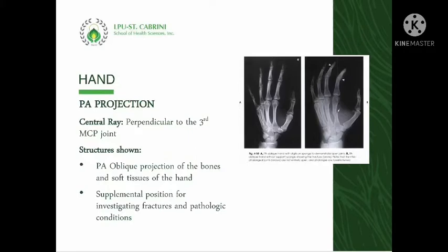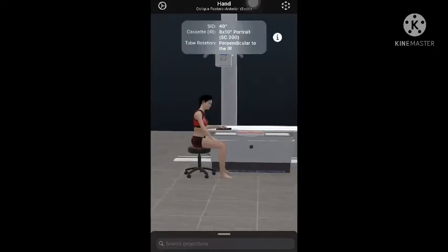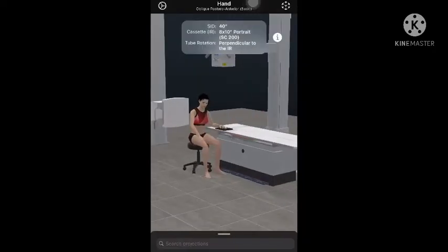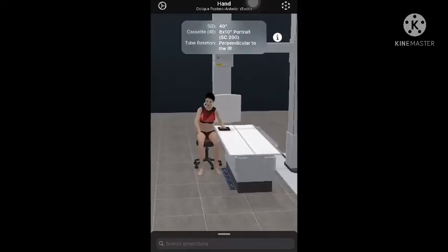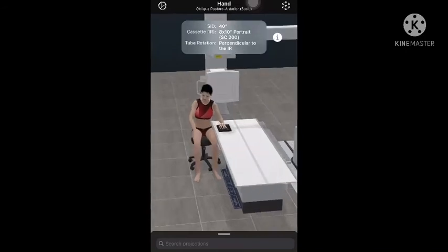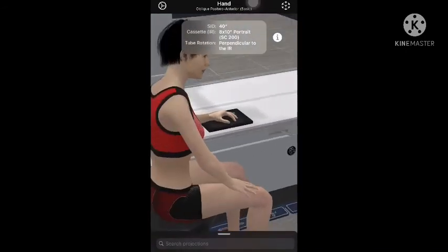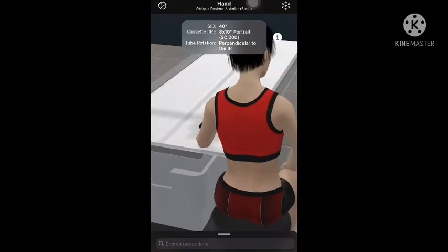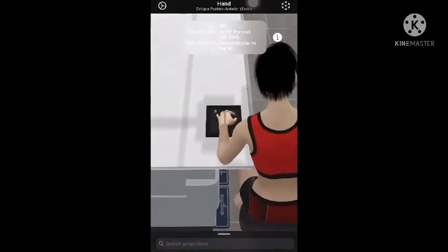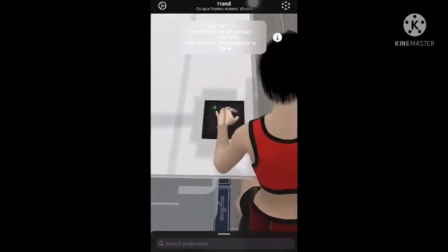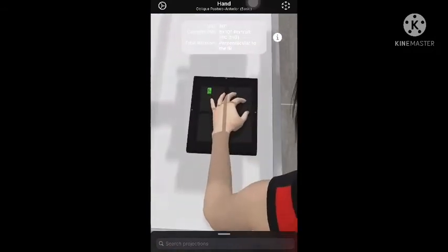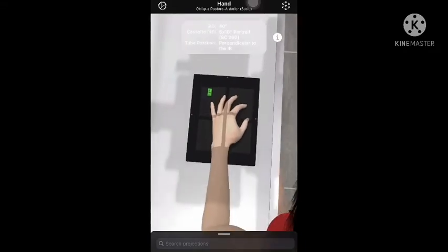The central ray is directed perpendicularly to the third metacarpal phalangeal joint. The radiograph will show the PA oblique projection of the bones and soft tissues of the hand. It has the same patient position as for the PA projection; the only difference is the part position, as the hand is placed in oblique. The demonstration shown does not use a sponge wedge.